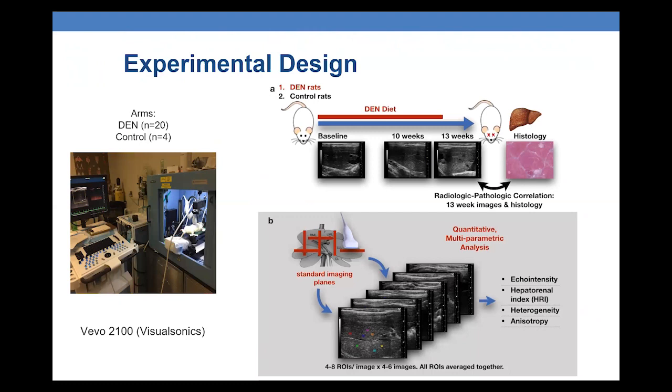No RF data currently, but just these 2 quantitative measurements, which represent the brightness and the variance, the coarseness of the tissue. But we were planning to add more features maybe in the future, going more broad.